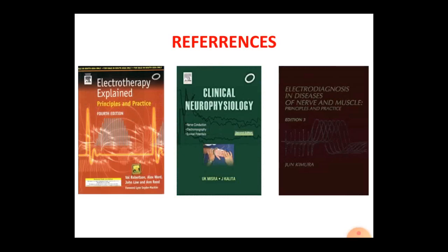This reference is prepared from Electrotherapy Explained Principles and Practice, Clinical Neurophysiology by Mishra and Kalita, and Electrodiagnosis in Disease of Nerve and Muscle by Kimura.